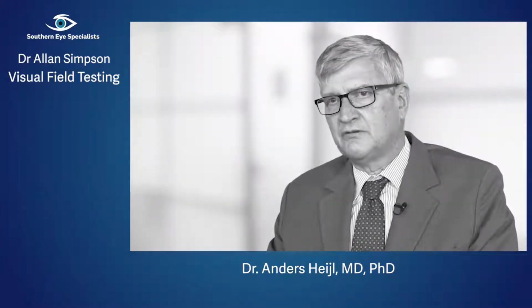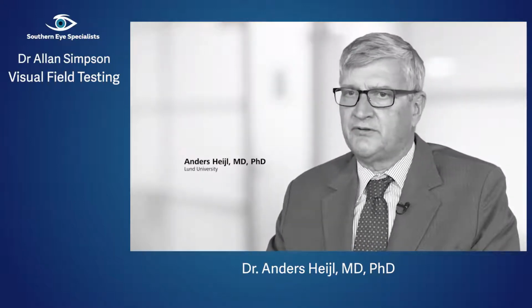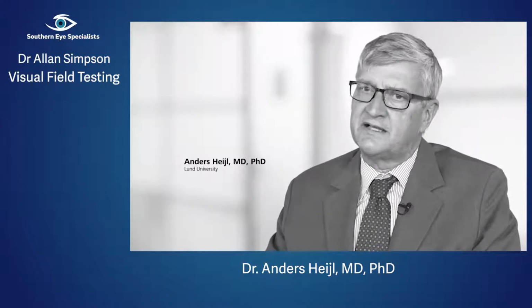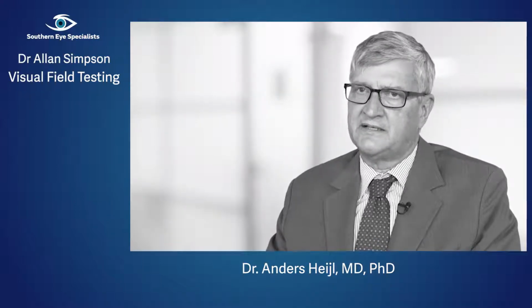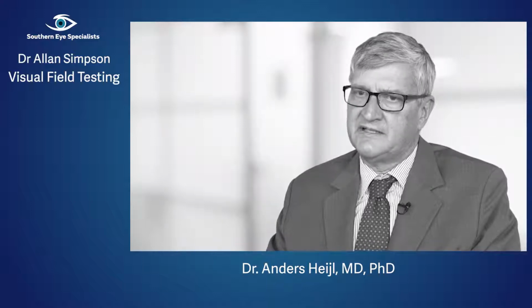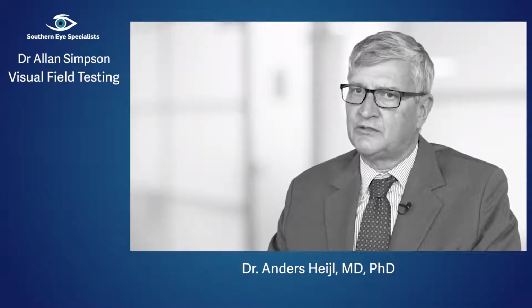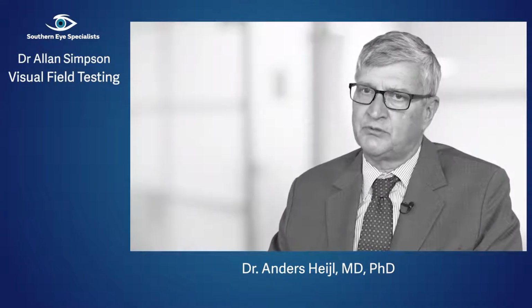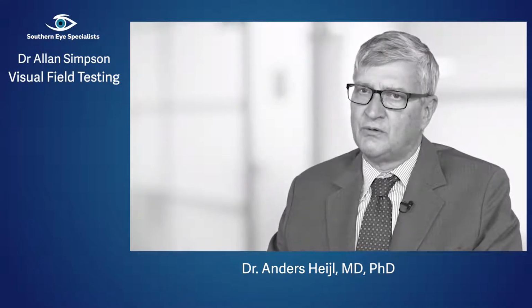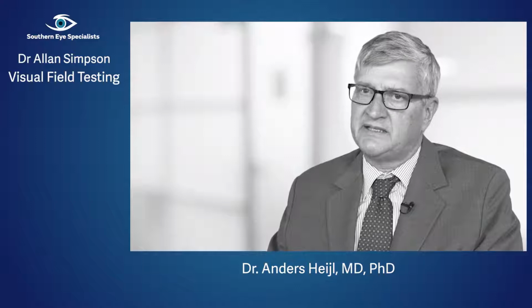There were a number of large randomized glaucoma trials that were completed between 2000 and 2005, and the results of those trials have changed the usage of perimetry, because the trials showed us that we had to measure rate of progression. Historically, perimetry was used for diagnosis and for determining whether an eye had gotten worse or not. But the trials taught us that the question of whether an eye has progressed or not is not the most important one. The important question is, what is the speed of worsening, the rate of progression? And in order to measure rate of progression, we need more data points.